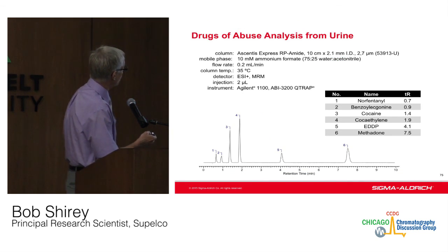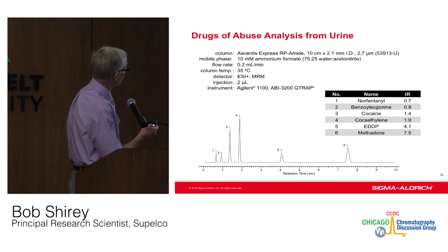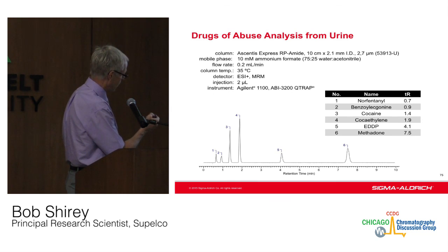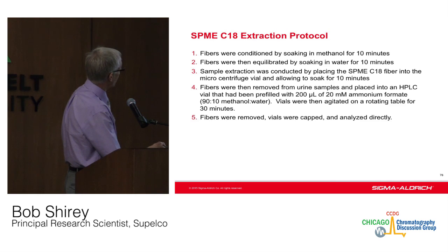We looked at drugs of abuse from urine. This was a study where we worked with Prosolia, looking at some of these compounds that were present in urine that were previously monitored by ELISA. To do this, we soak the fibers for 10 minutes in methanol and water, and then extract the samples and then desorb them in methanol with a little bit of ammonium formate.